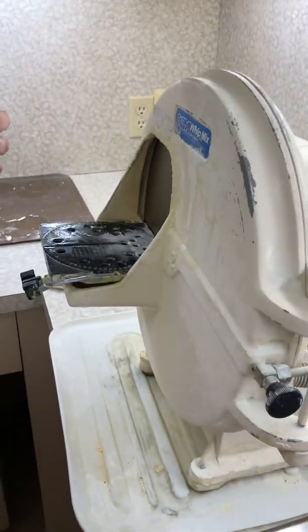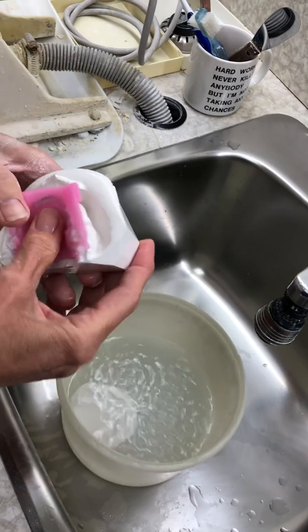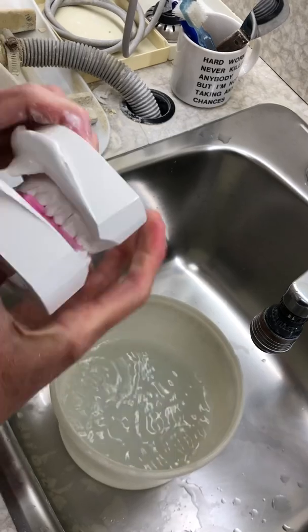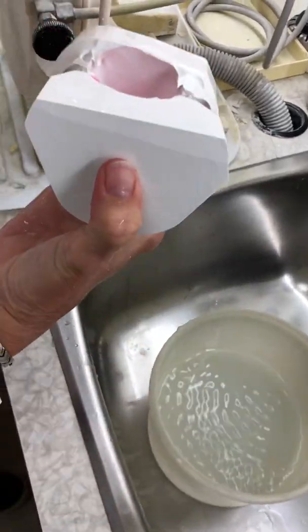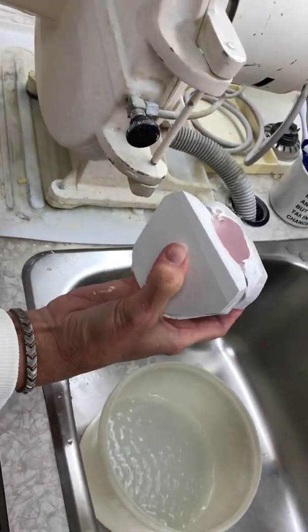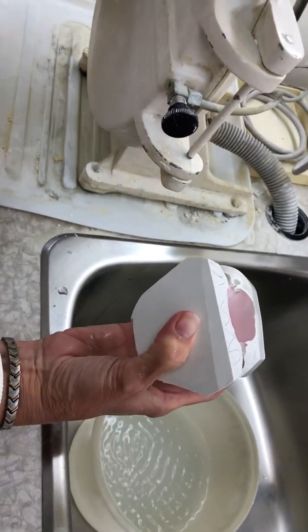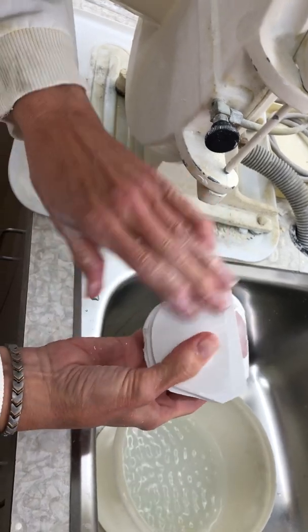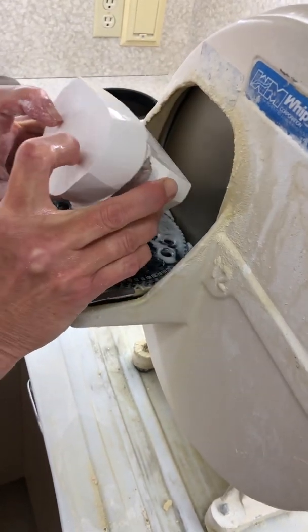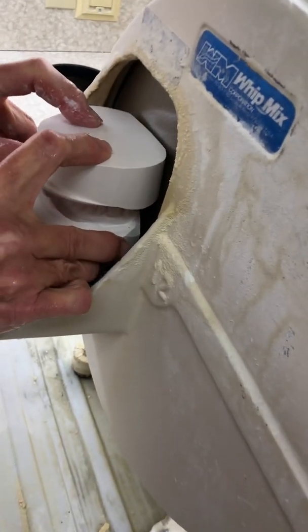Now, this is where the wax bite comes in. So we're going to take the upper model, and we've got our wax bite, and then we're going to take the bottom, and we'll just get that locked together. All right, so there we go. Now, you can see we've got extra here. You can push away and figure out what you want to do, but I've found the easiest way is to take my pencil and just score the back of that. Because we know this is perpendicular, we can lay that there, and when we go in to grind, I can tell that this side needs a bit more, so I'm going to give a bit more pressure here.